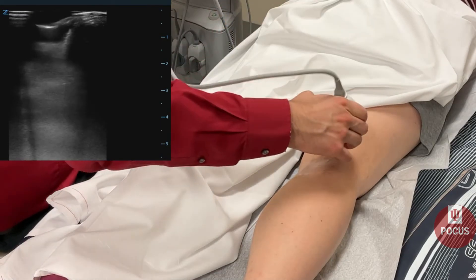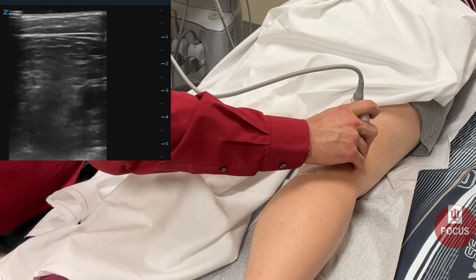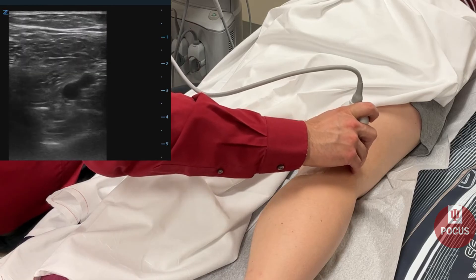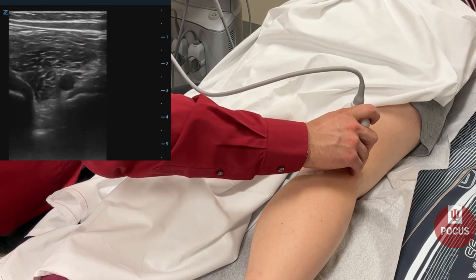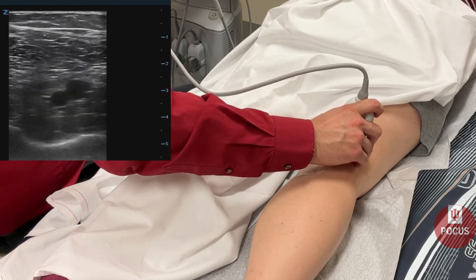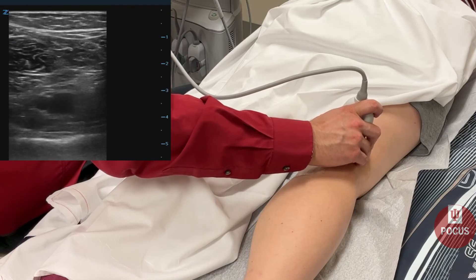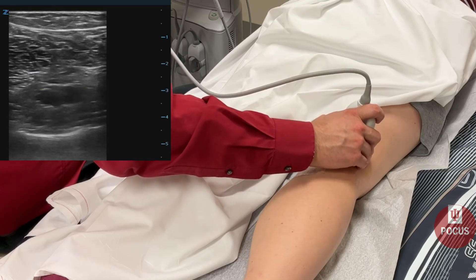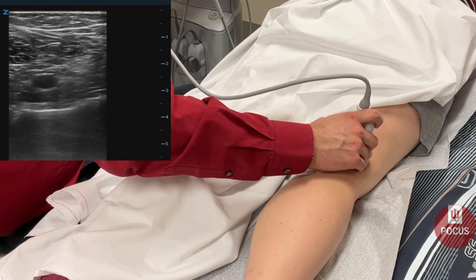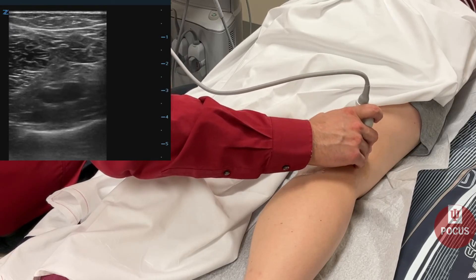Next, we'll have our patient turn over. We can look at the vessels in the posterior knee — the popliteal artery and vein. The vein should be easily compressible.